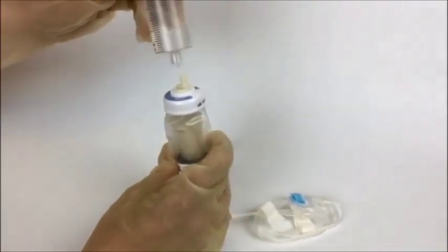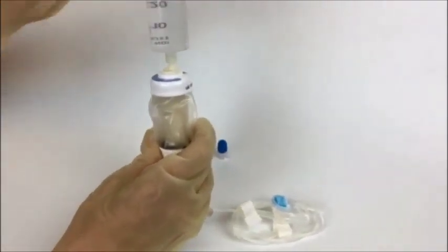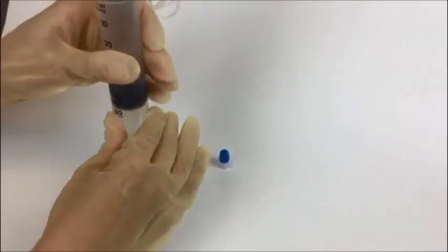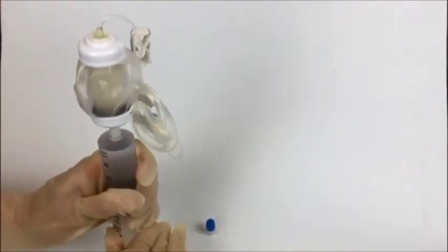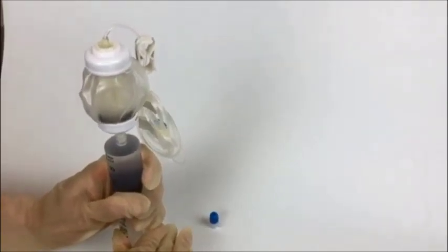The SMARTeZ pump can now be filled with a syringe or automatic filling pump. Remember to remove trapped air from the filling device and attach it securely to the fill port. Do not over-tighten the connection to the fill port.